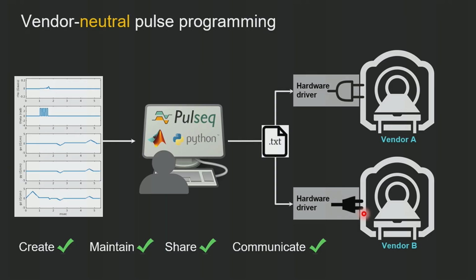So the idea here is that we're specifying everything going on in the pulse sequence using Pulseq, using probably some open source tools to do that, which I'll touch on. That's going to give us our text file, which is going to be the same text file that we take to a GE site, a Siemens site, your scanner vendor site, to translate into that specific hardware. But doing that open source and stated up front, hopefully that takes care of some of that variability that we see if you were to program that individually on each site.